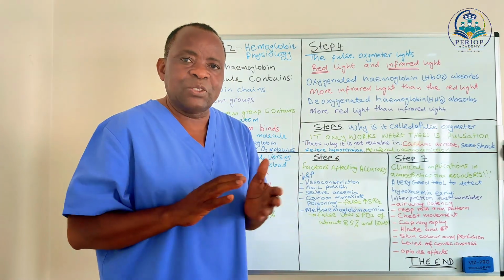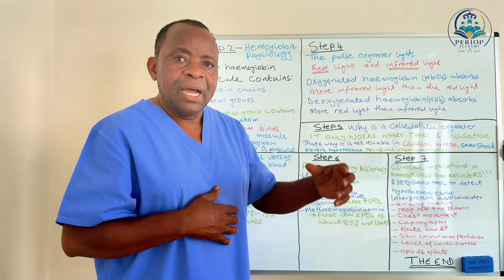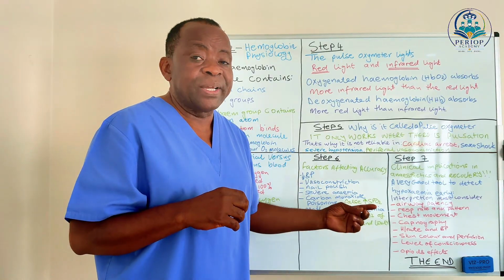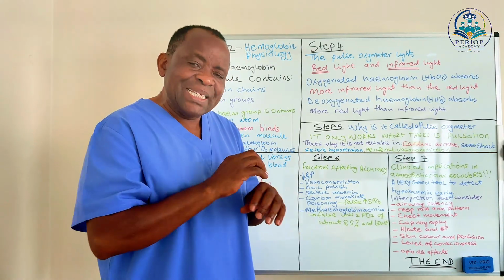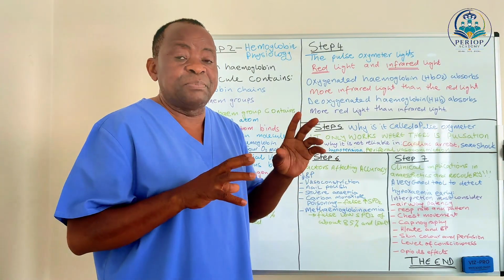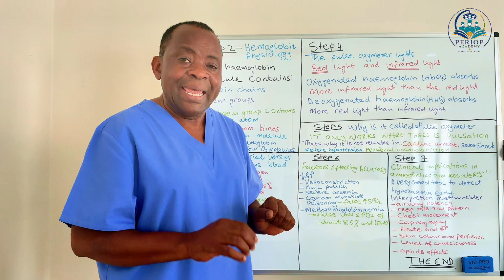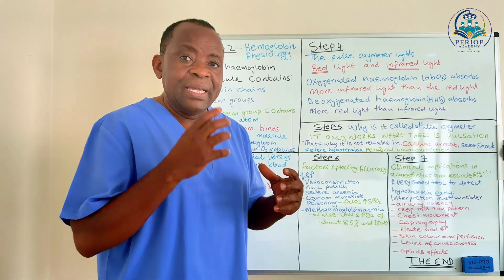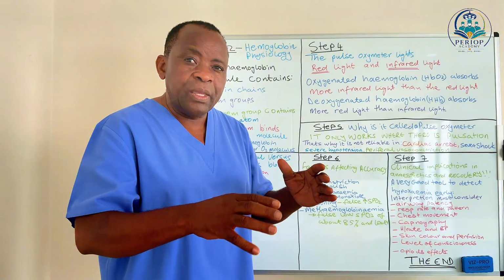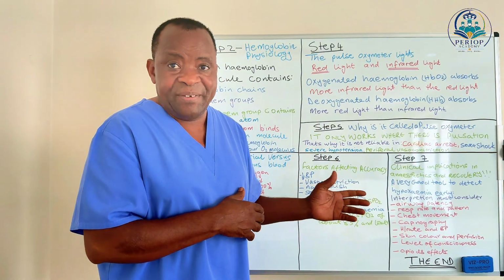When the patient has got the Hudson mask, or the simple mask as we want to call it, we still have an attachment for capnography. However, that is just a simple measure to see that the patient is breathing. It doesn't give us the actual values as compared to the LMA or iGel or whatever adjunct you have in there.